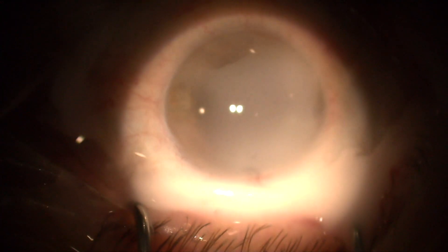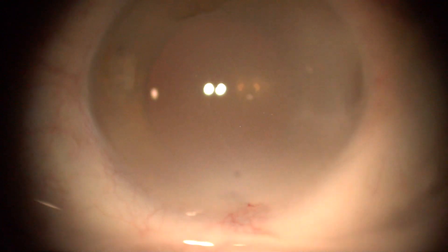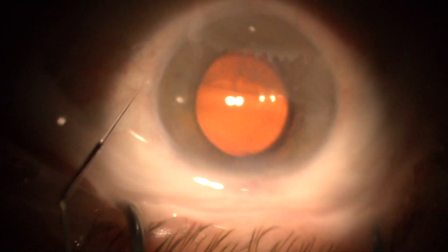We use Simbrinta drops at the end of cataract surgery to reduce ocular pressure in the post-operative period. In addition to achieving excellent pressure control, we perform a Seidel test with Simbrinta. This patient presents a positive Seidel test.